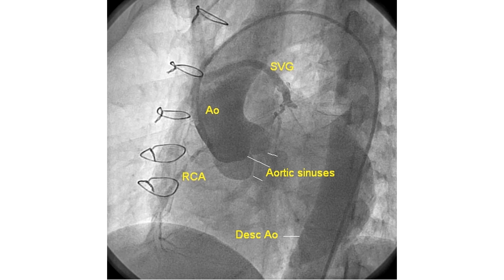Very often, cannulation of SVG by this technique is feasible. It is needless to say that direct injection into the SVG gives better visualization than an aortic root angiogram, at a lesser volume of angiographic contrast agent.